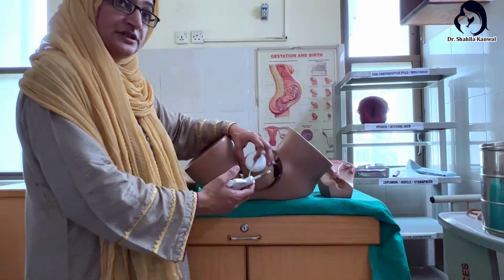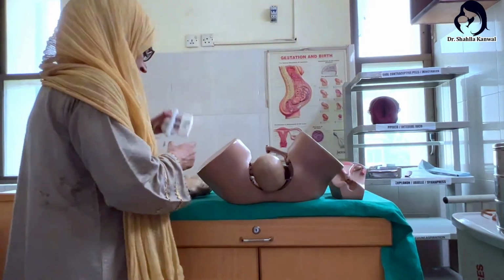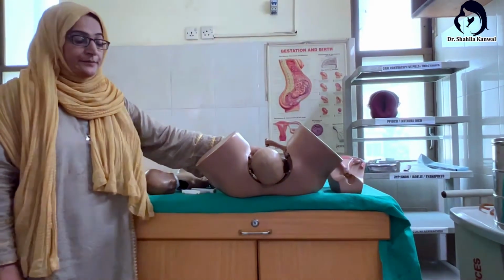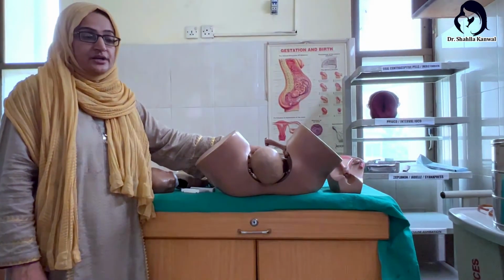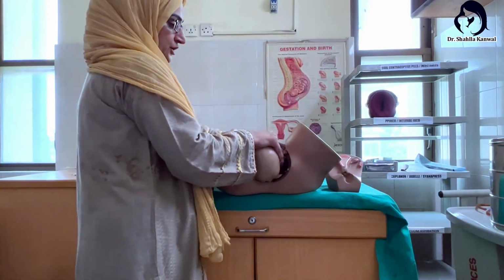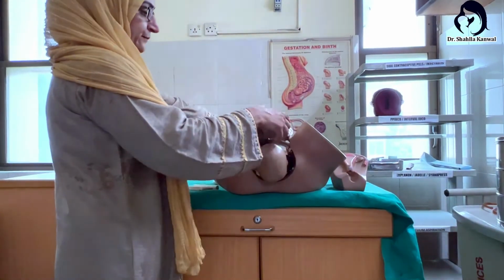This is the delivery of the fetal head by the Omni cup. You have to press this button so that the pressure is released. After releasing the pressure, now the head is delivered. Complete the delivery in the usual fashion, and do the active management of the third stage of labor, and check for any bleeding after the delivery of the baby. Put the baby on the maternal abdomen for the early essential newborn care, like that.